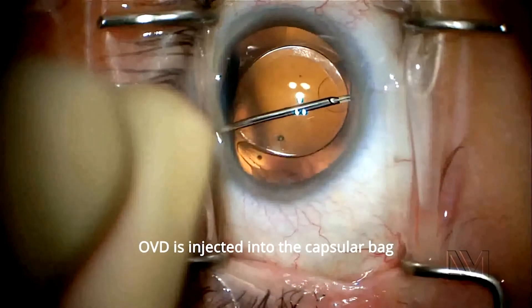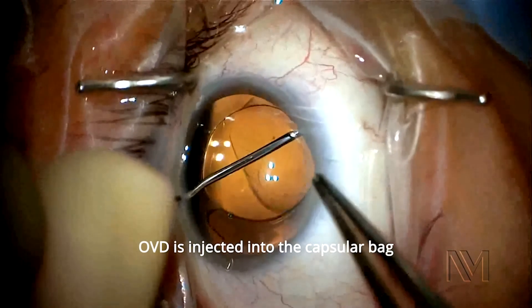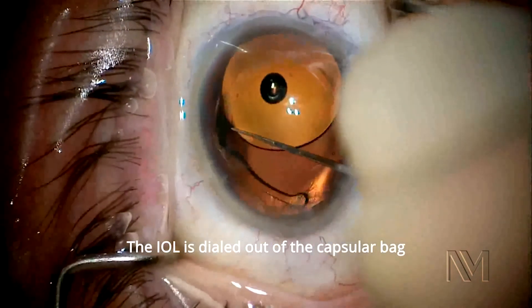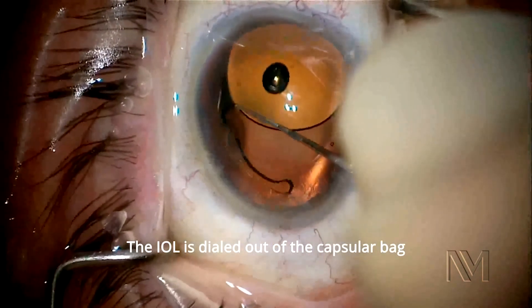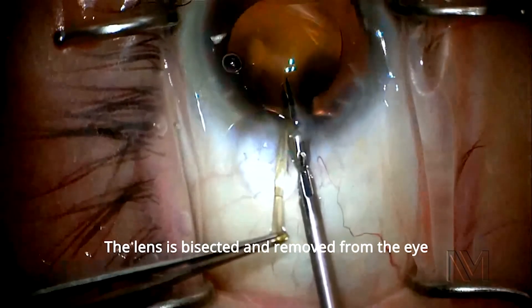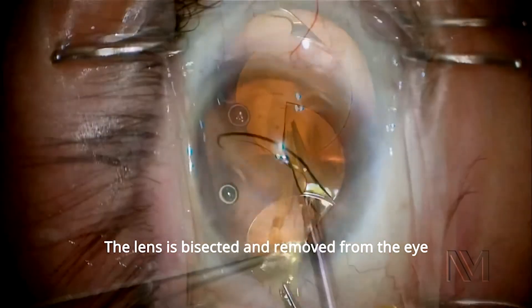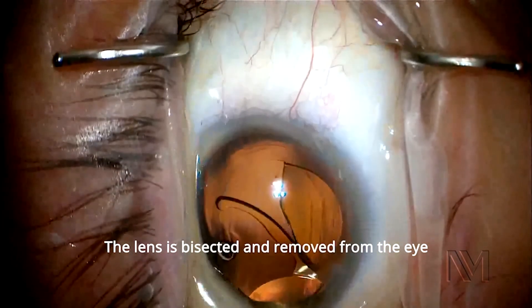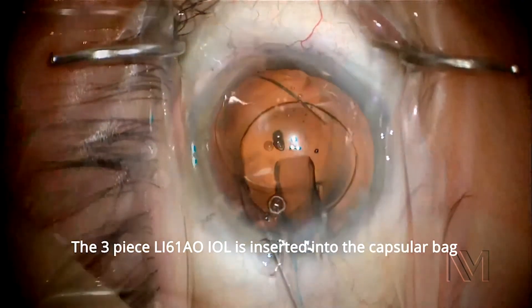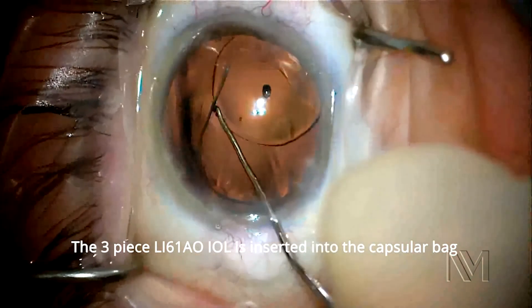The surgical procedure started with injecting a cohesive OVD behind the intraocular lens and all around it. After carefully mobilizing the intraocular lens, it was collapsed into the anterior chamber, bisected, and removed from the eye.